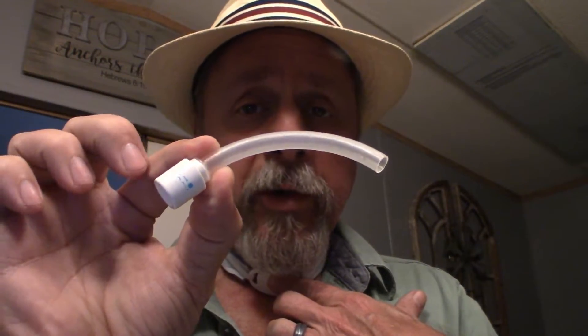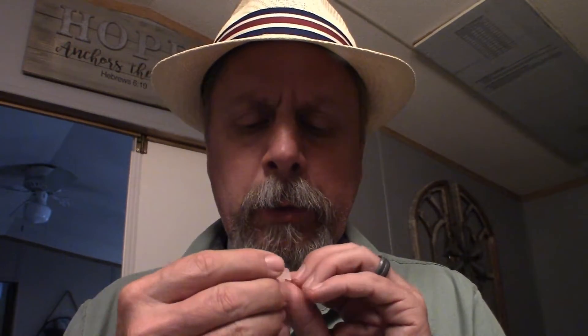New trach in, new straps on. Now you need to put in an inner cannula — and that's simple. Just put it in, turn it to lock, and you're done. Then you can put your speaking valve back on. This one has a little string, a little hook — you can put it on there, that way if you do have to take this off, it hangs right there on your trach.